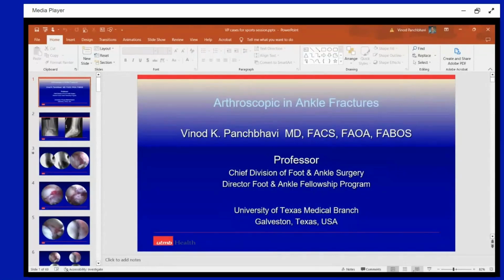And then, of course, you have the Maisonneuve type injuries, where there is, of course, gross syndesmotic instability. There's a minimum of two ligaments that are ruptured. And so it must be unstable. In those cases, I will always have a look at the anterior syndesmosis before putting the screws in, so while reducing it, to really see that the anterior tubercle of the tibia and fibula are well aligned, to see at that corner, the anterolateral corner of the joint.